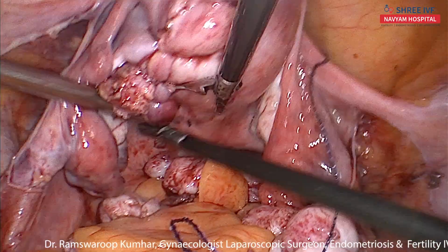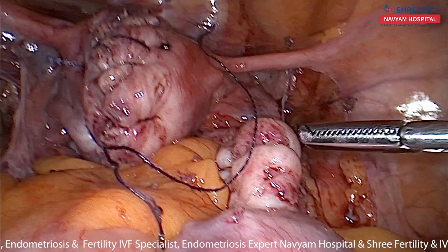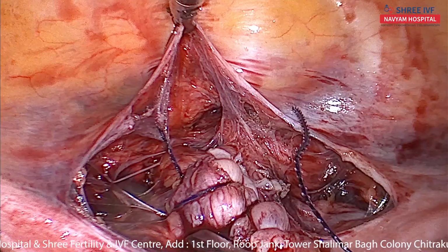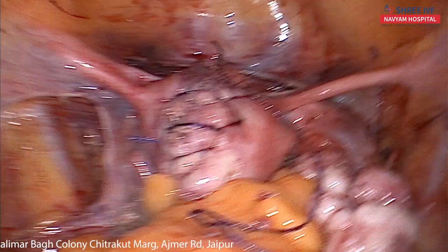And this is the home. And you can see. Okay. Anteriorly show the final picture. Fine. Now bleeding, everything is okay. Right. Thank you very much. Bye bye.